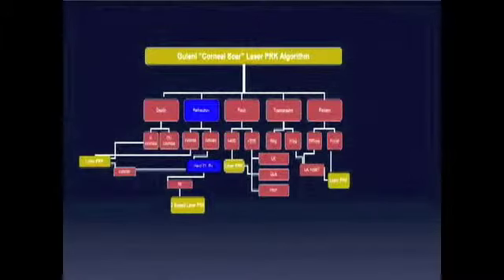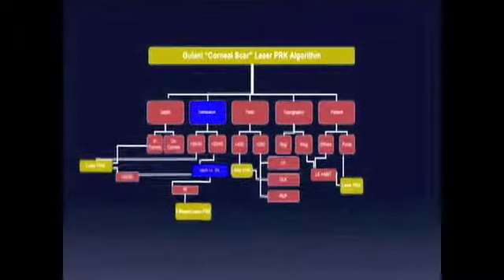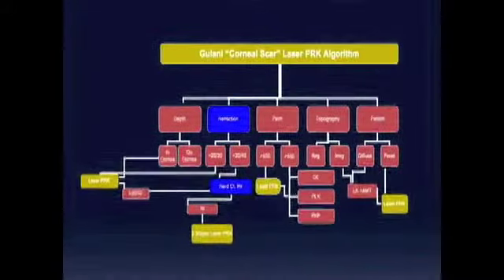The refraction is the mainstay of the corneal scar algorithm, where vision better than 20/30 suggests straight laser PRK, while less than 20/40 following a hard contact lens trial can determine staged laser in 2 stages or a scar peel followed by myopic laser ablation.